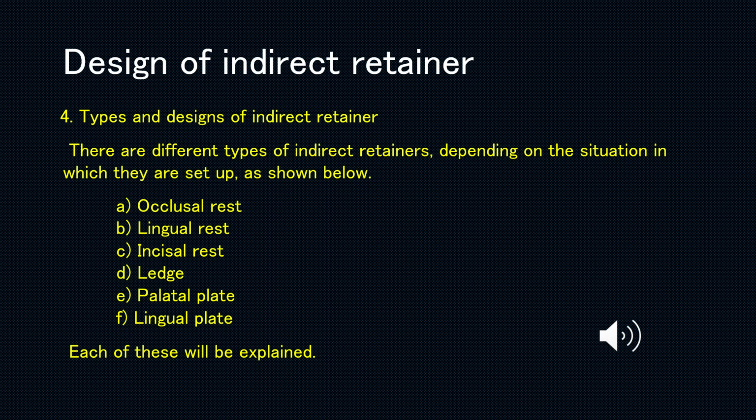B. Lingual rest. C. Incisal rest. D. Ledge. E. Palatal plate. F. Lingual plate. Each of these will be explained.